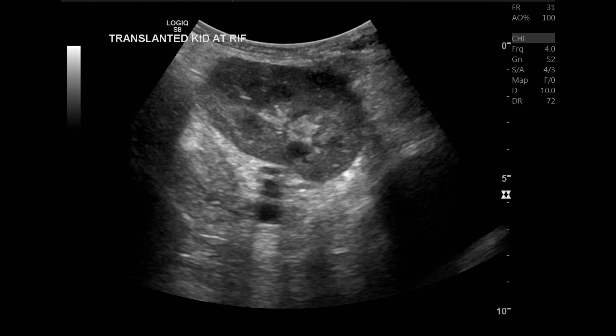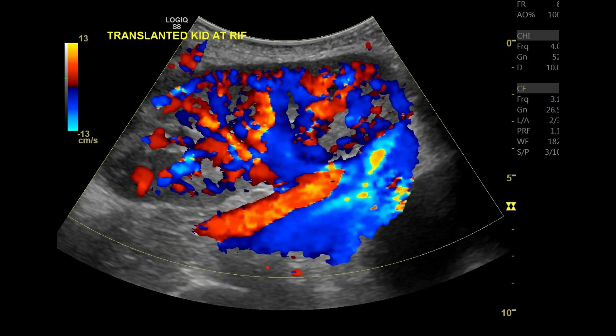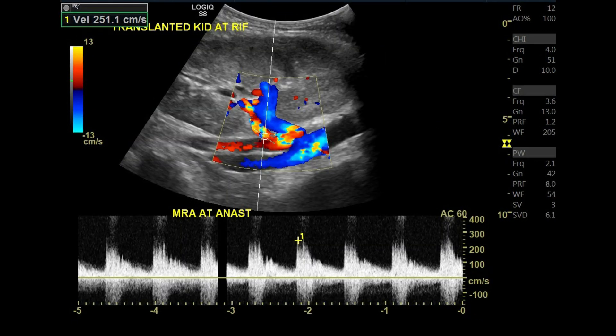After that, we move to the Doppler study. First, we assess the graft perfusion — here we have good perfusion over the transplanted kidney, with good blood supply reaching all over the kidney. Then we scan the main renal vein to make sure that it is patent.